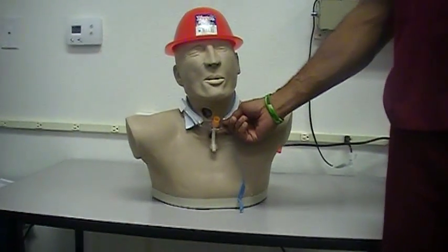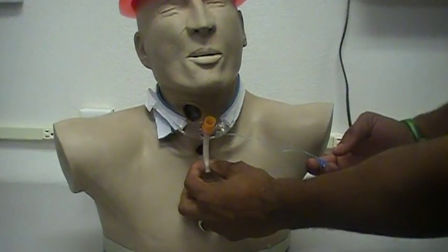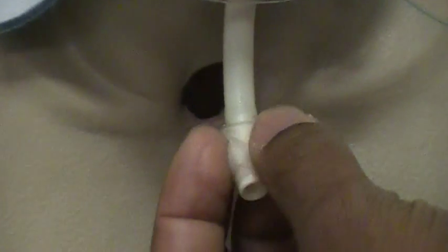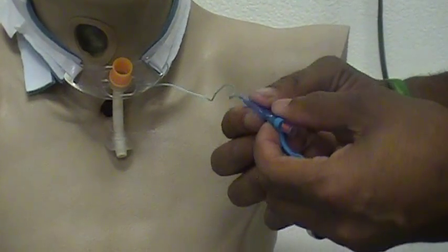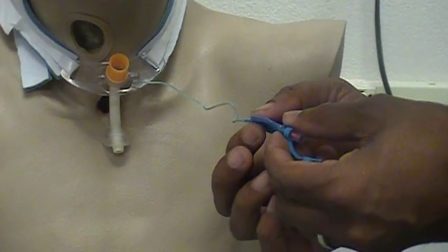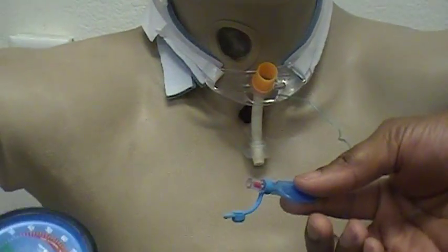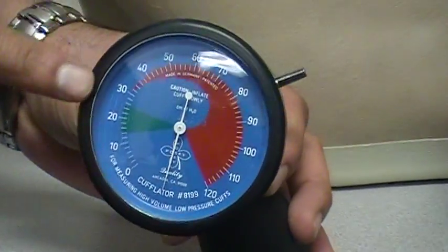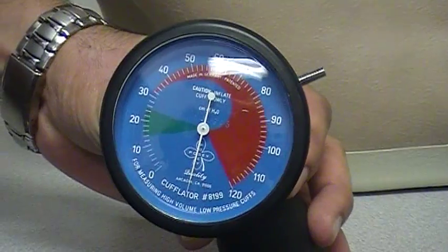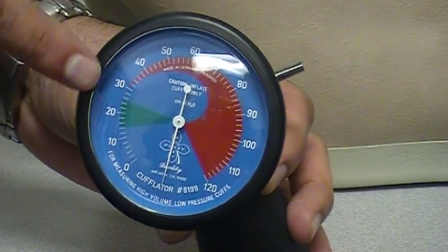This is his tracheostomy tube that we're going to be inflating. Right here is the cuff — this small bag, balloon-type part of the tracheostomy tube. This is actually the pilot balloon, which is the only actual balloon on here. This is inflated and this inflates the actual cuff. The equipment we use to inflate the balloon is called a cufflator, and basically what it does is give us the measurement on how much pressure we have on the cuff.